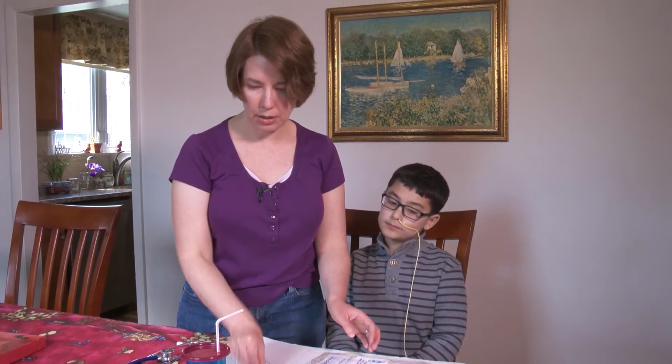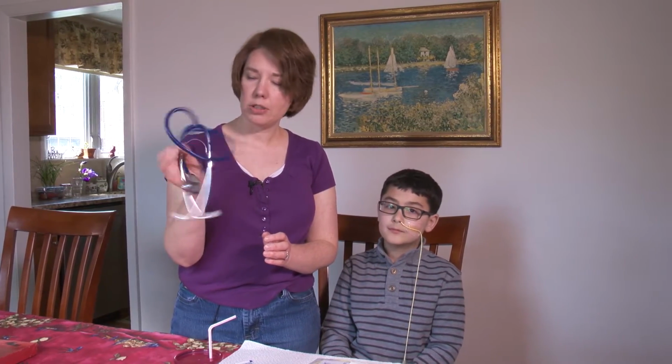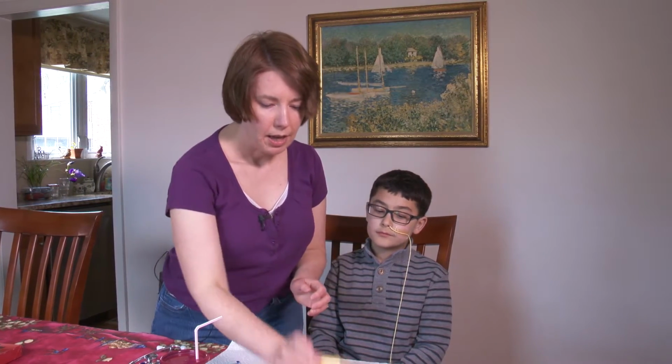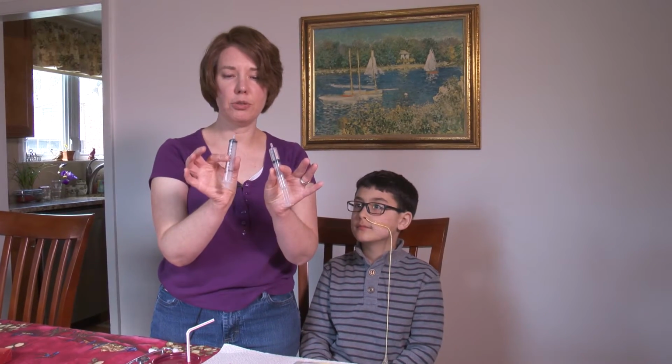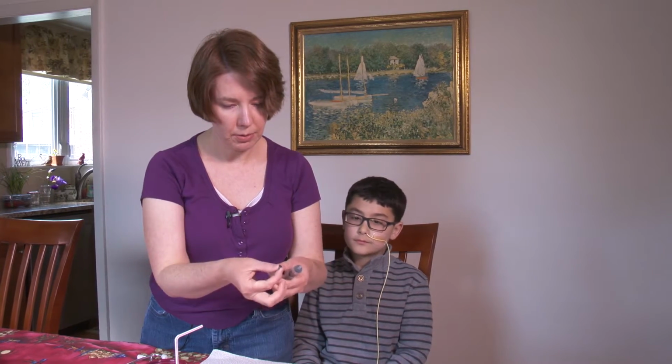I have a marker to mark it with. I have a stethoscope to check the placement, and you can just get a real cheap $5 stethoscope. It doesn't need to be anything fancy. I have pH paper for checking the placement. I have 2 10cc syringes that have slip tip for the placement.